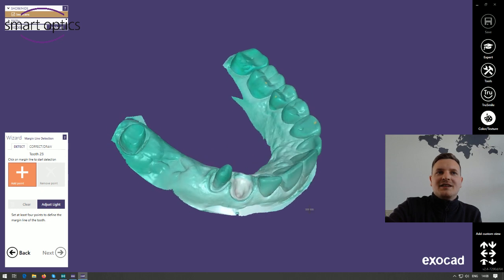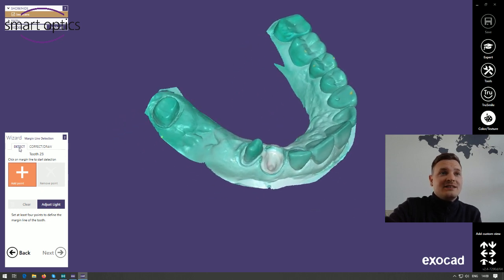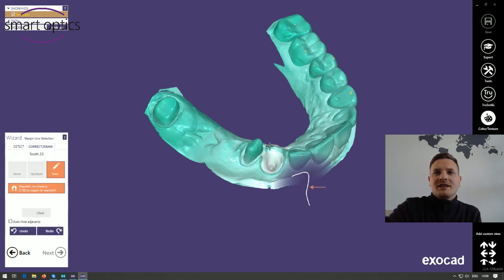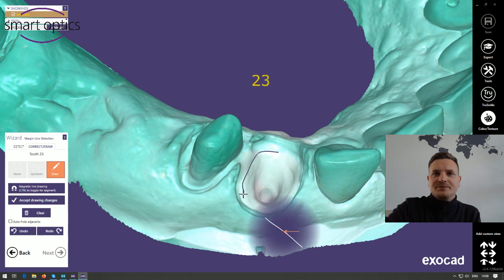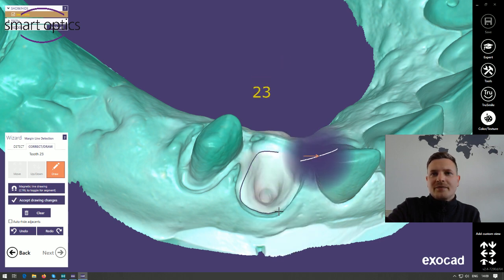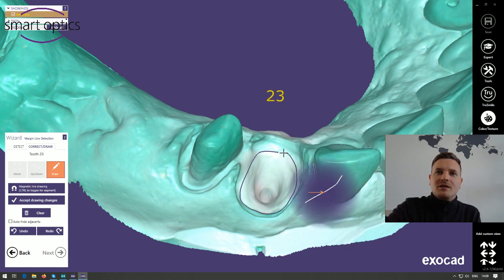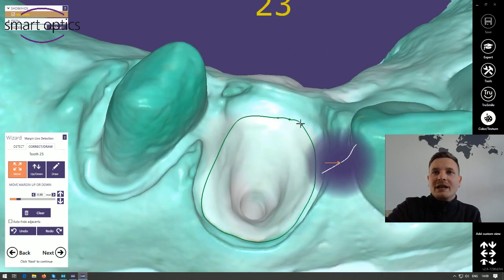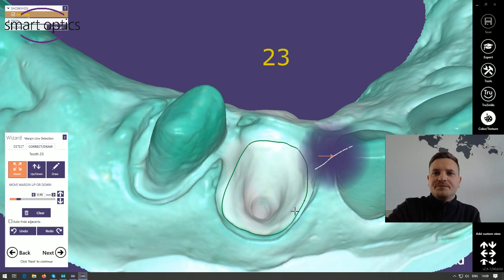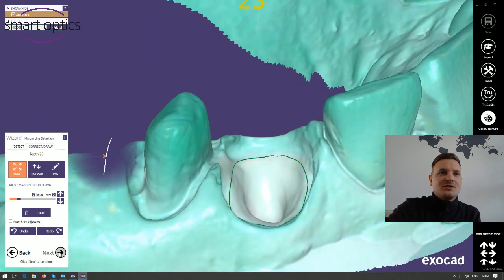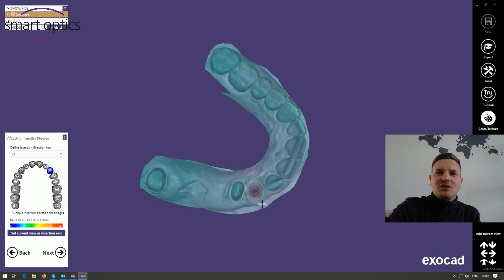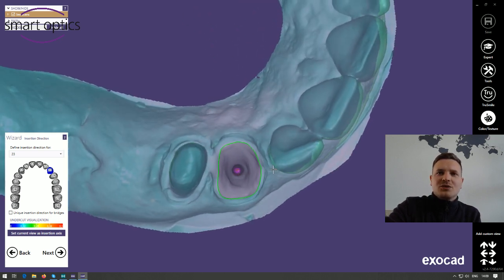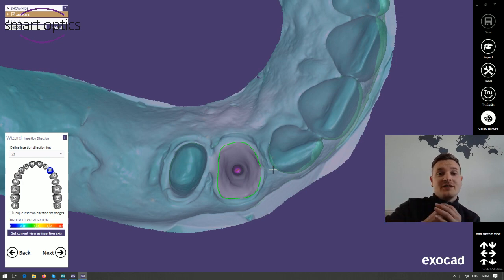Now it's time to detect the margin line. You can choose the detection function or the drawing function. In this case I'll choose the drawing function without the magnetic line, so I just put some points here. I'm able to move the points manually with the mouse, but it looks okay. I go next to create the bottom. Now we need to choose a correct insertion direction — I choose one view looking to the deepest point of the post and core, set this view as insertion direction, and go next.